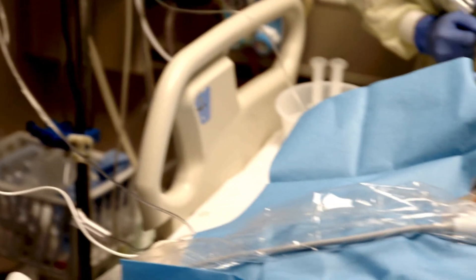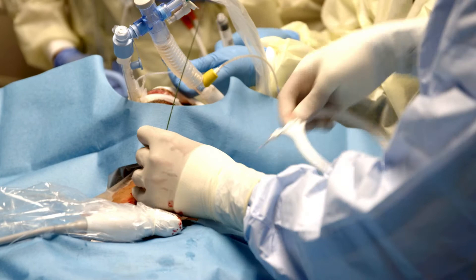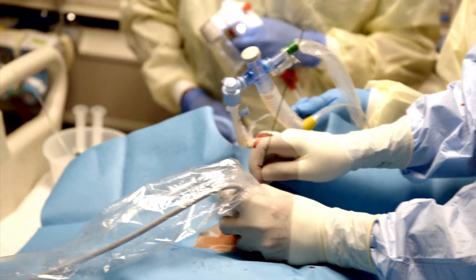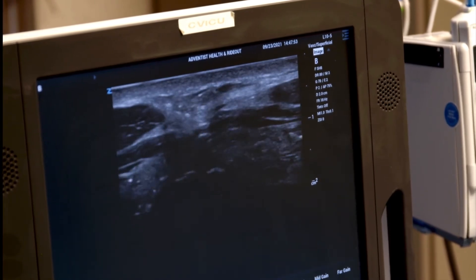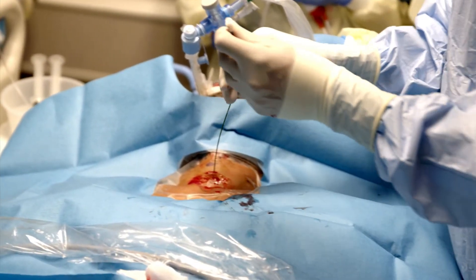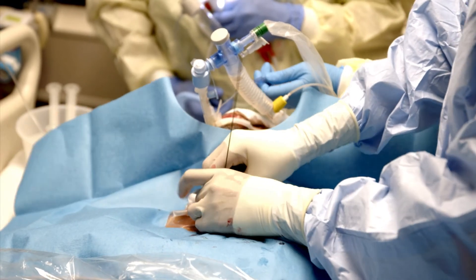Just like with a central line. There's a little bit of resistance when pushing against the endotracheal tube, but now it's flowing in freely. If you're having issues with hypoxia, you can put the balloon up and ventilate the patient. He's 100%, so we're moving forward. You can look with the ultrasound again and see where your needle is going — right in the center of the screen, anterior to the trachea. When I push down you get a faint movement downward, confirming the wire is going toward the carina. I'm comfortable proceeding to dilate here with the 14 French dilator — went in pretty easy.